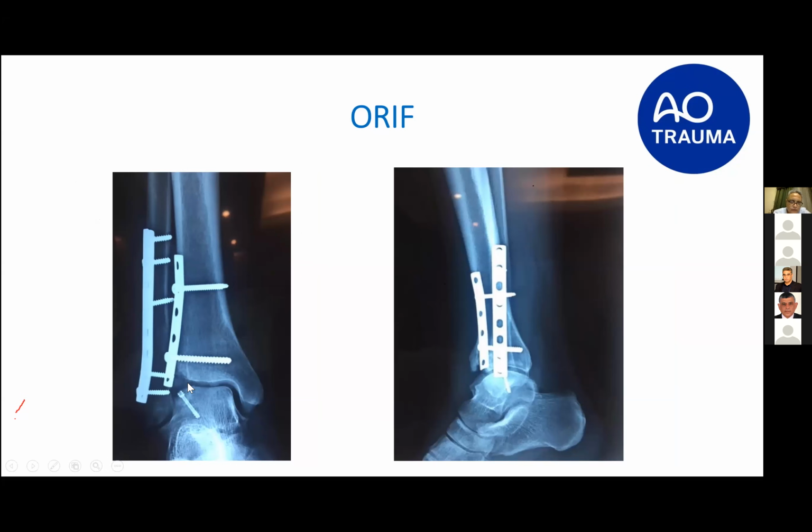Actually, I'm not worried about this corner being empty so long as the ankle is stable, because I think it is better for it to be empty than to have callus, exuberant callus or osteophyte in it. And I know that arthroscopically you always remove the spurs or loose bodies from this region without harm. So I'd like to ask you, did you remove this fragment while you were removing the K wire, or was it just absorbed or had it disappeared?